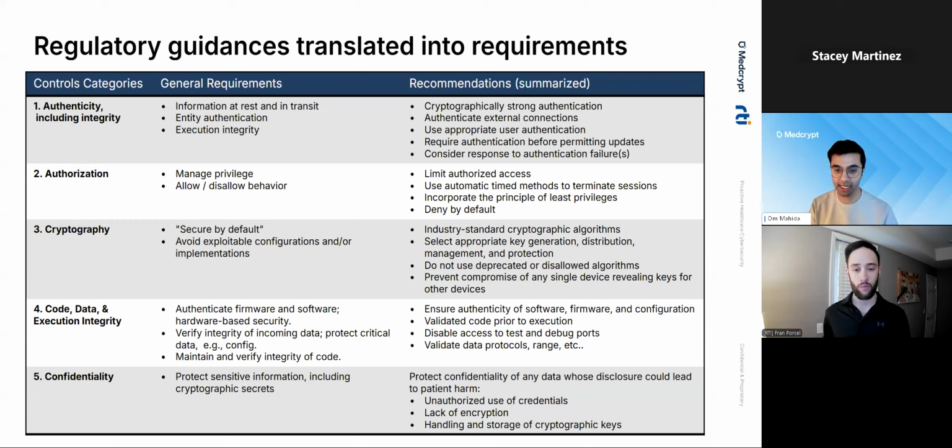Making sure when you're sending data between different components of the system, both internal to the medical device, but also to external endpoints, that data is encrypted. There's authentication of each endpoint, not just the server, but mutual authentication. And you're really trying to ensure the integrity of that data.